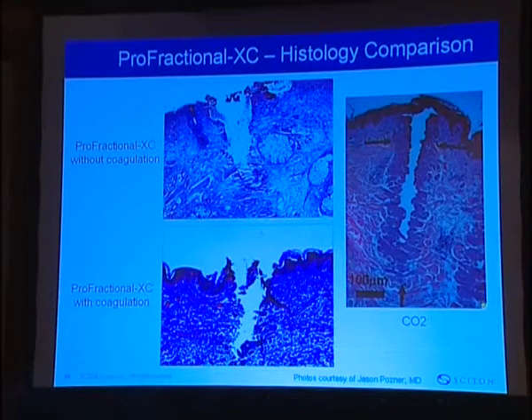So the treatment goals here are to remove the visible signs of skin damage, rejuvenate the dermal collagen matrix for improved tone and texture, and provide a safe, effective treatment with short downtime. And the applications are skin resurfacing and coagulation of the soft tissue, and this could be the outcome.